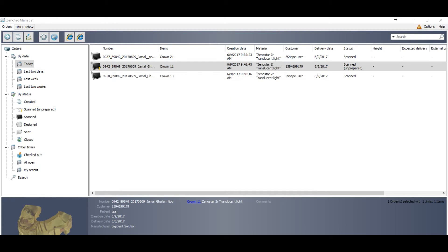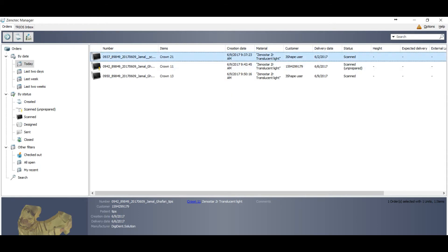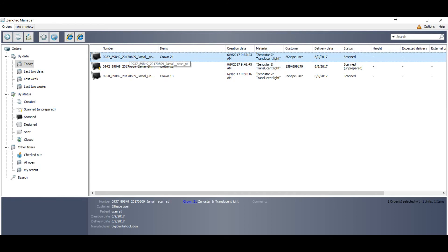So this is the easiest way to export as the STL your DCM files. But if this option is not opened on your dongle, then there is another way you can export your DCM files into STL.